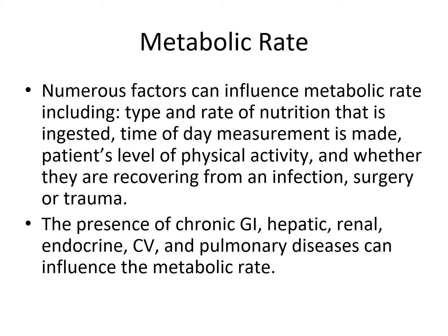Looking at things that are going to affect the metabolic rate. There are so many different factors, including the type and rate of nutrition that is being ingested, so rate meaning whether it's given IV or through tube feeding. The time of the day the measurement is being made when they're measuring these gases.